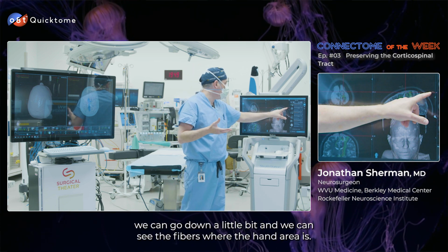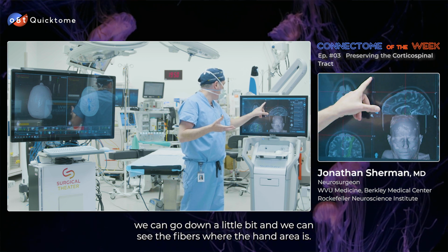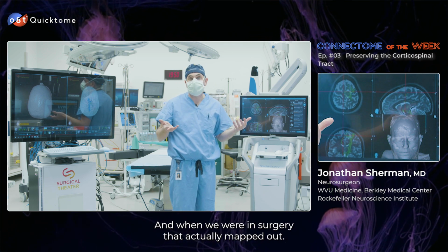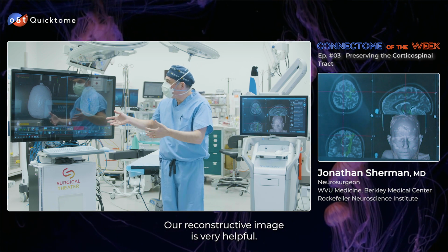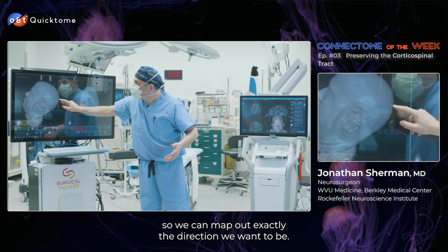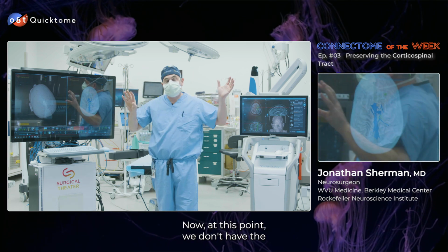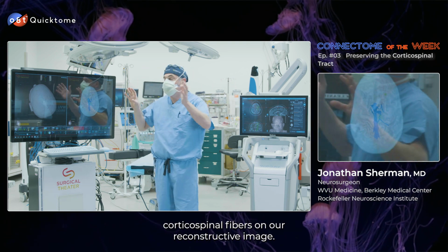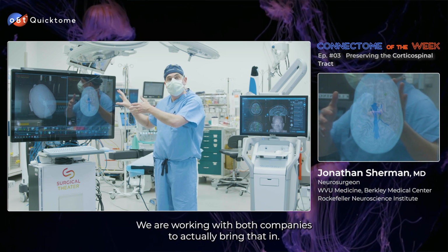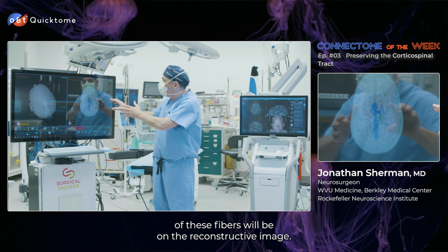And then on top of that, we can go down a little bit and we can see the fibers where the hand area is, and when we were in surgery that actually mapped out. Our reconstructive image is very helpful. On the left here we can see the patient's head, so we can map out exactly the direction we want to be. Now at this point we don't have the corticospinal fibers on our reconstructive image. We are working with both companies to actually bring that in, so that's a work in progress where all of these fibers will be on the reconstructive image.